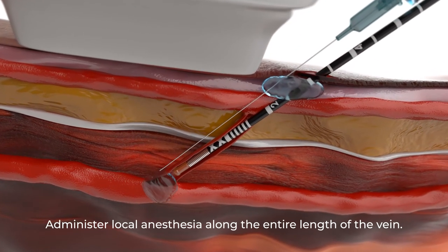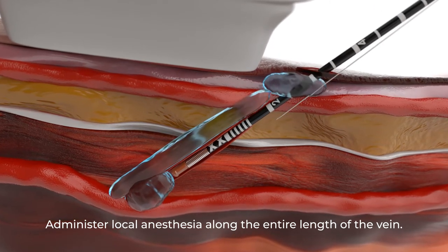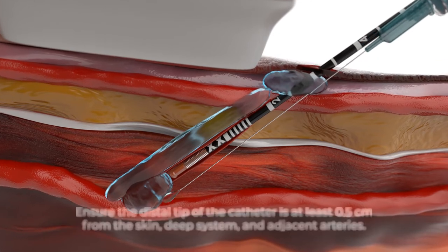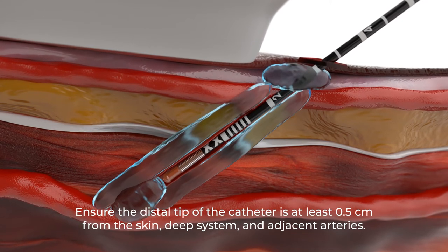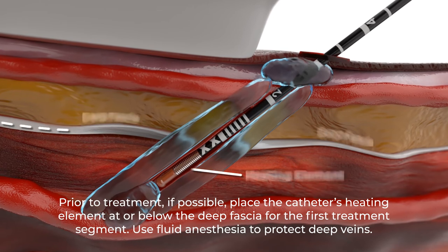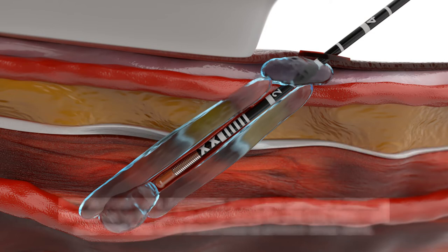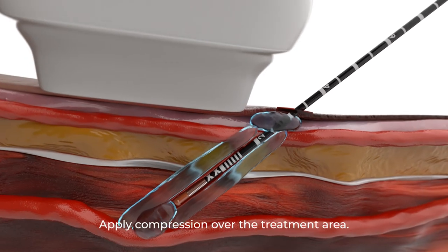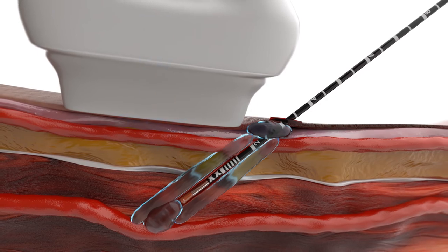Inject local anesthesia adjacent to the vein wall to create a layer of fluid around the vessel. Ensure the distal tip of the catheter is at least 0.5 centimeters from the skin, deep system, and adjacent arteries. Prior to treatment, if possible, place the catheter's heating element at or below the deep fascia for the first treatment segment. Use fluid anesthesia to protect deep veins. Ensure good vein wall apposition with the heating element by applying external compression.